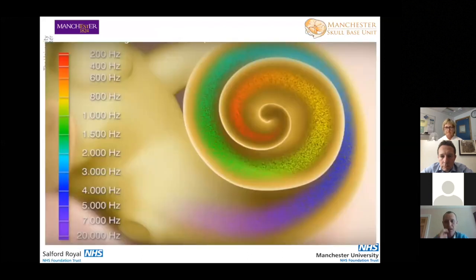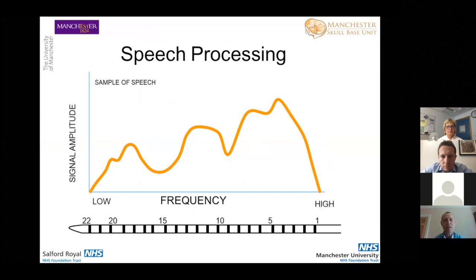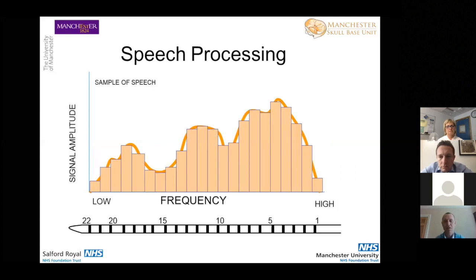And what that means is that for postlingually deafened patients, the cochlea is tonotopic. So stimulation at the basal turn gives high frequency sound to the brain, and at the apical turn gives low frequency. Now, if you consider speech, that tends to break down into fundamental frequencies, which are displayed in this graph. And what a cochlear implant is able to do is, because it only has a limited number of electrodes, we need to equate those fundamental frequencies to specific electrodes. And so by stimulating at specific points in the cochlear implant, we can mimic those fundamental frequencies in blocks, as is displayed in this graph.